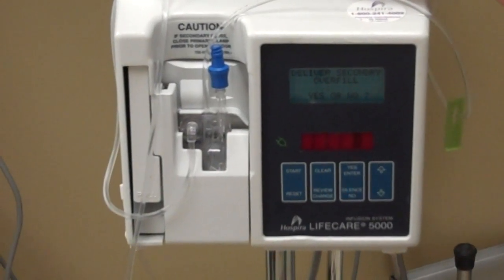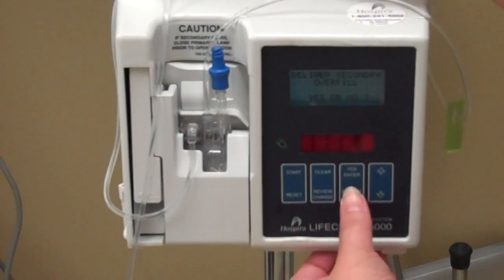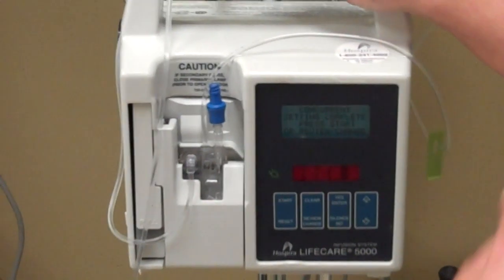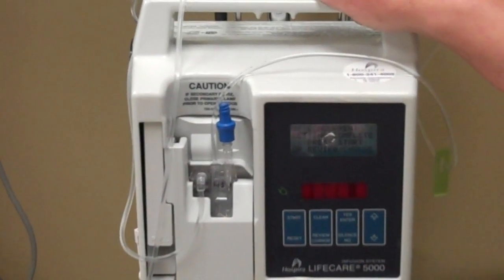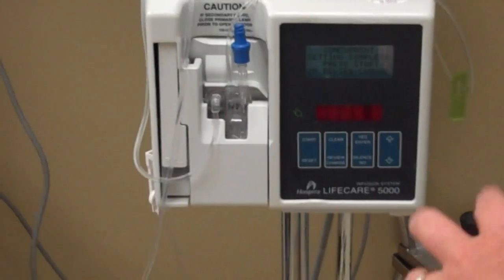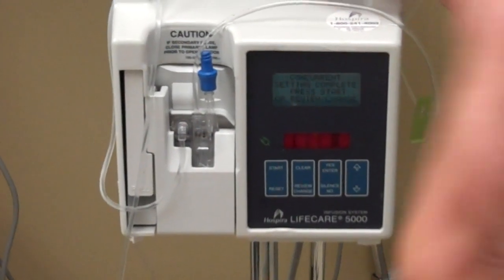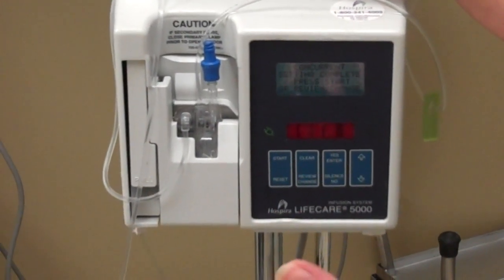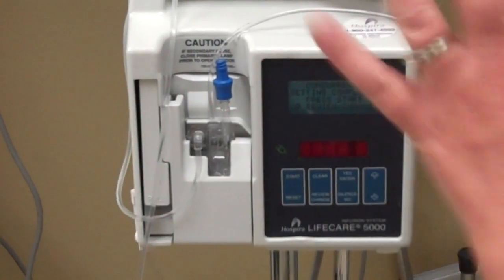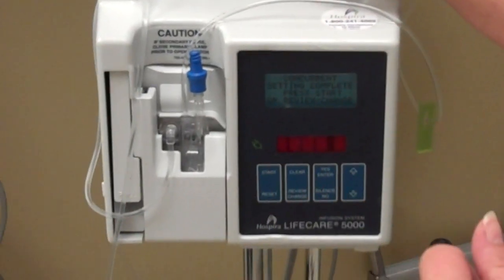Deliver secondary overfill means do you want it to continue running after 50 cc is already infused? No, you do not — unless a patient needs to maintain their blood pressure. In that case, you'd set a dose limit of 50 so that when 50 cc goes in it starts to beep, but it won't quit — it will continue to infuse. At 50 cc you can run in, see the bag's almost empty, and get a new one before it runs out so your patient's blood pressure won't be affected.